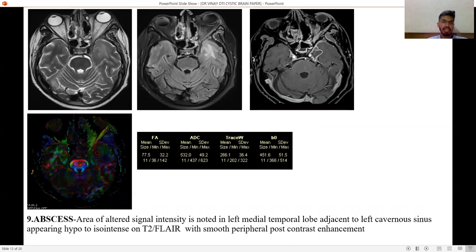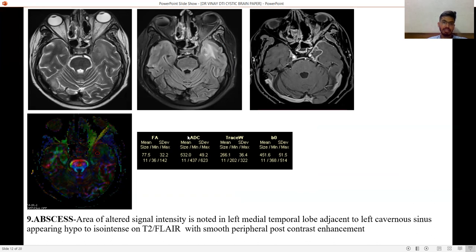Next is abscess — an area of altered signal intensity noted in the left medial temporal lobe adjacent to the left cavernous sinus, appearing hypointense to isointense on T2 FLAIR, with smooth peripheral post-contrast enhancement. In abscess, ADC value is low.